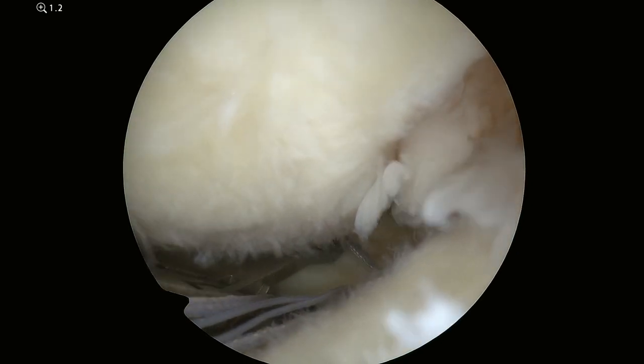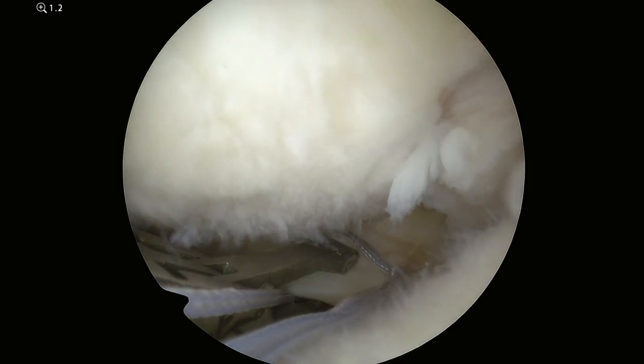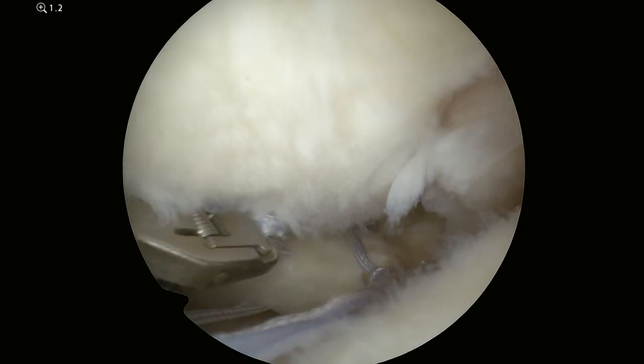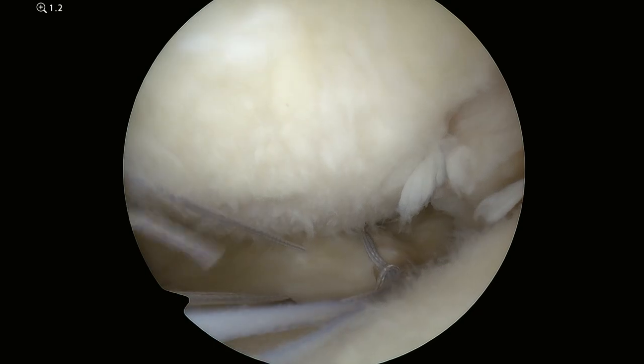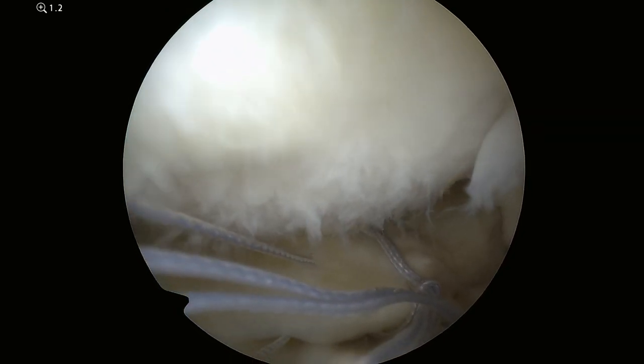Now I'm passing stitches through the meniscus. It's a little suture passer and the stitch has a loop at one end and you cinch it together, similar to tying the identification tags on your luggage at the airport, and this is cinching it down.